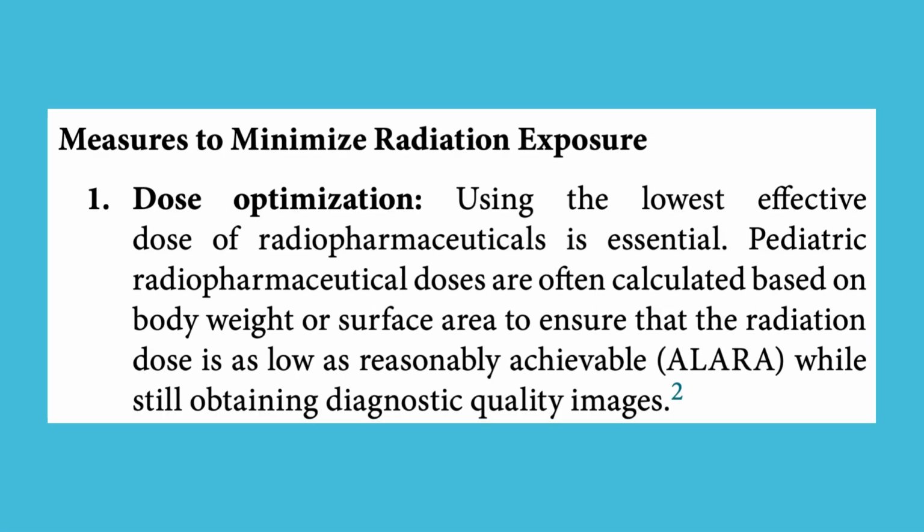Measures to minimize radiation exposure. 1. Dose optimization. Using the lowest effective dose of radiopharmaceuticals is essential. Pediatric radiopharmaceutical doses are often calculated based on body weight or surface area to ensure that the radiation dose is as low as reasonably achievable, ALARA, while still obtaining diagnostic quality images.